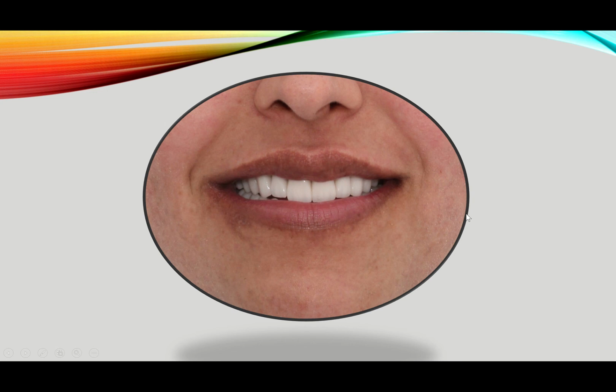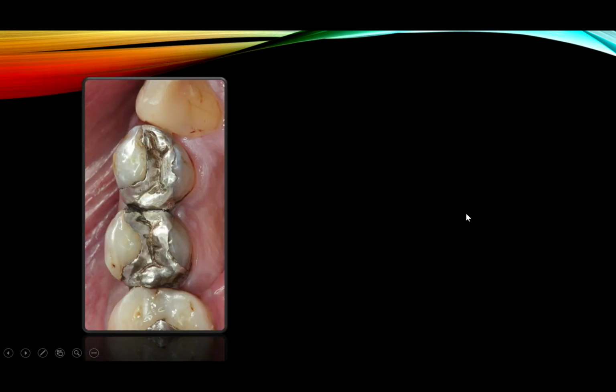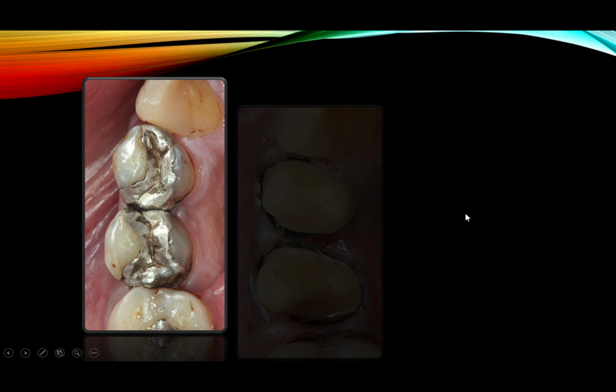So anyway, we cut back the whole facial. All right, not just micro layering, we cut back the whole facial. So you can say that we ended up almost with layering. But I don't see much difference between layering and micro layering really. Let me show you monolithic.